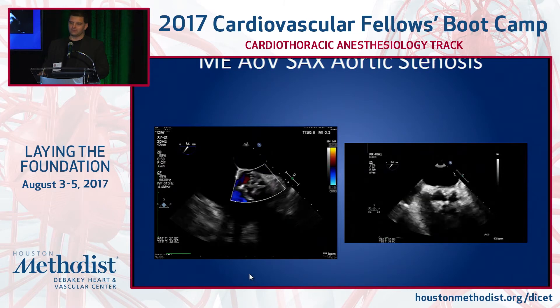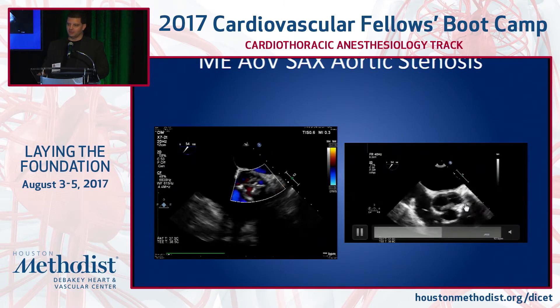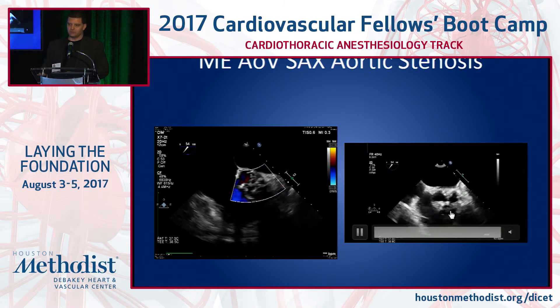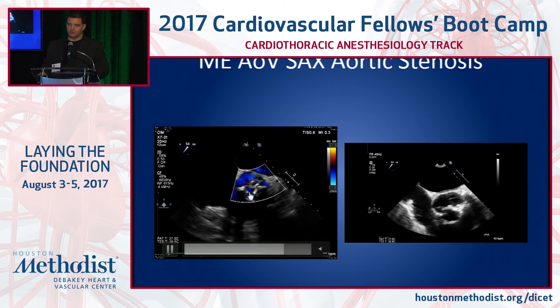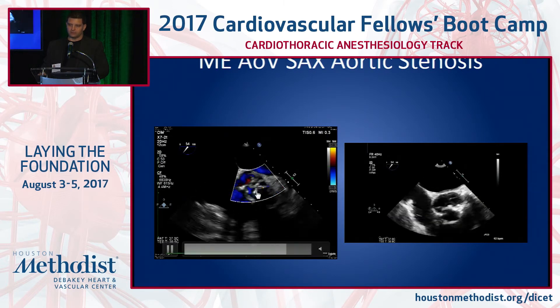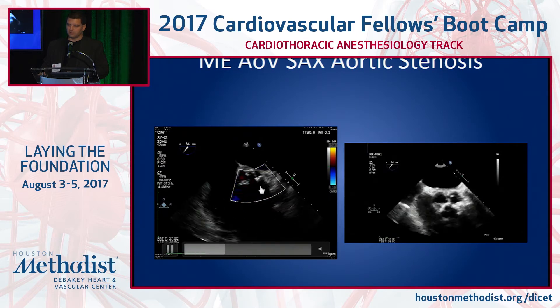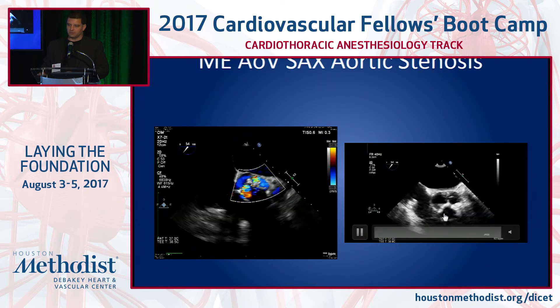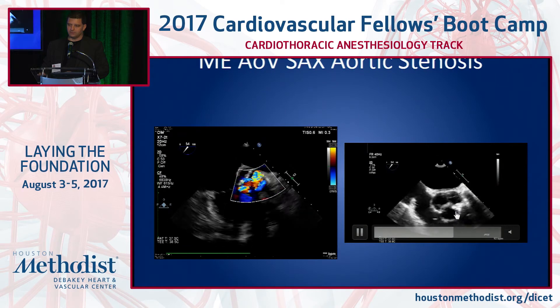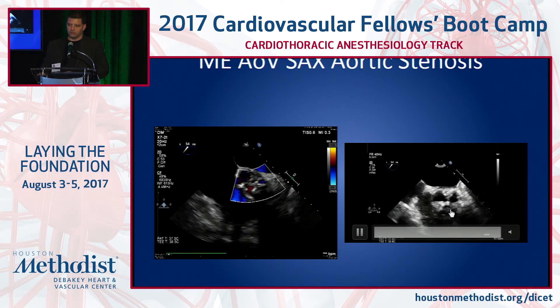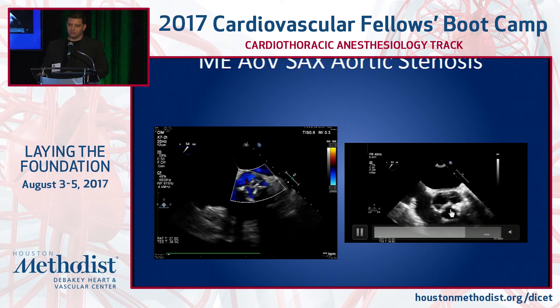Short axis aortic valve, midesophageal. You have a stenotic valve. You can see the three cusps not quite opening properly. It may be associated with aortic regurgitation or not — you can see the color Doppler flow on one side and the non-color Doppler flow on the other. Clearly calcified, thickened, not opening and not closing properly.